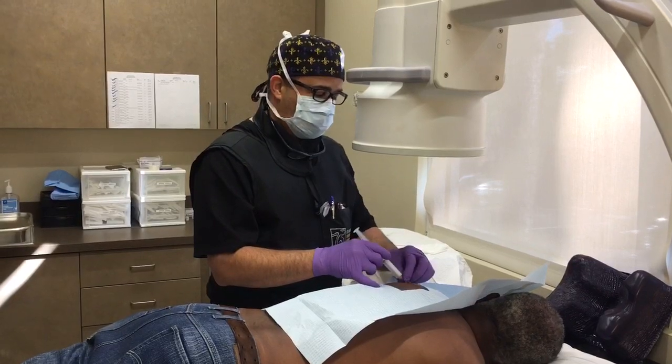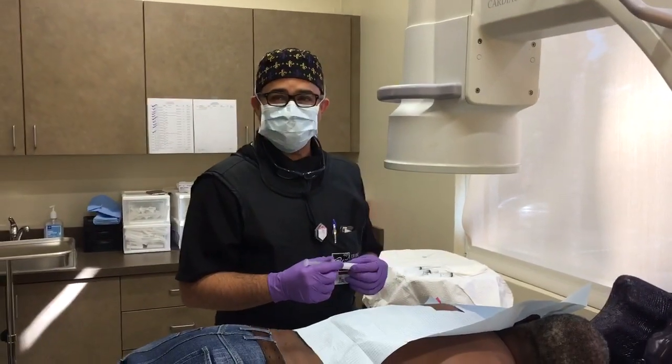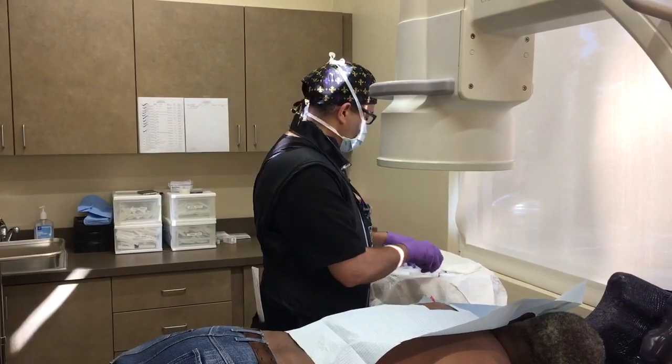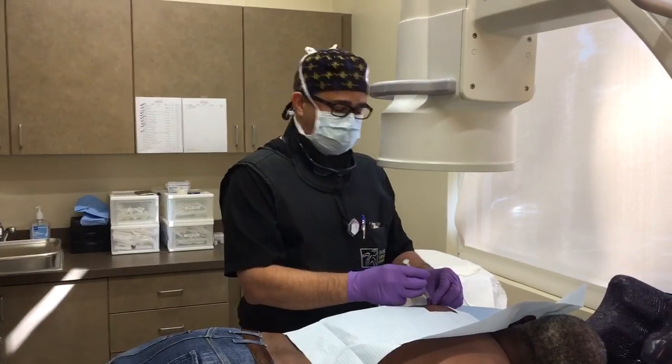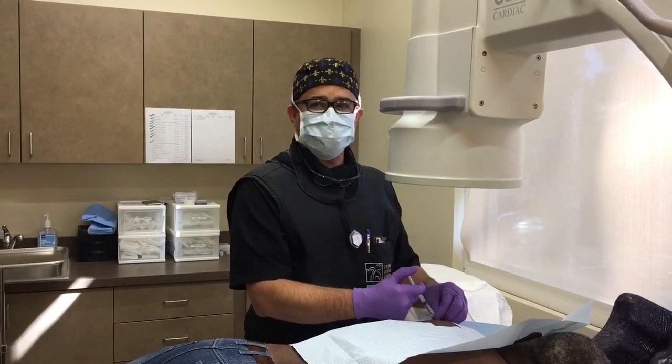I'm going to use our introducer needle and confirm placement in the joint space with the fluoroscope. Then I'm going to inject a little contrast dye, which is going to confirm the placement within the joint space.